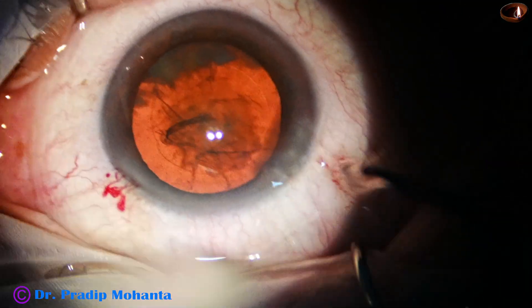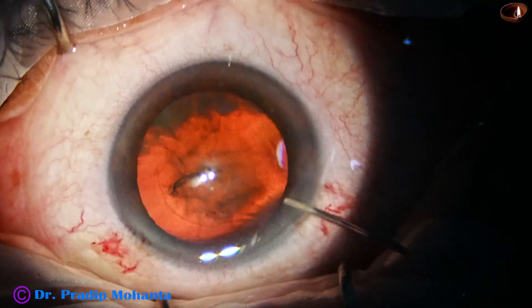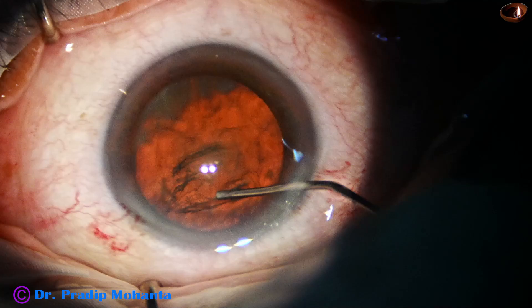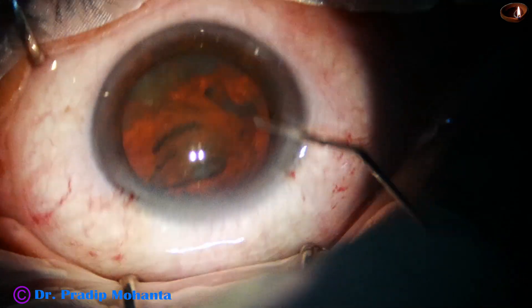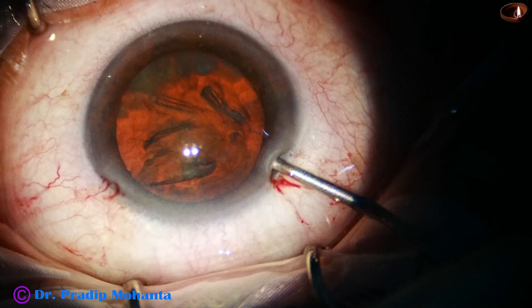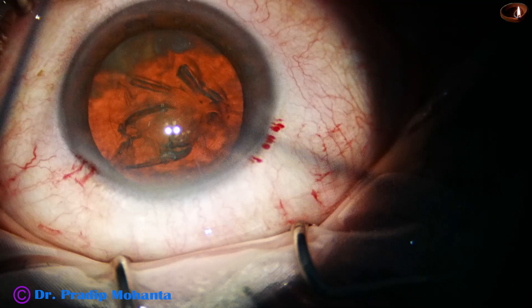But this is actually a cataract which is harder than grade 3. Capsulorhexis is done. Hydrodissection is done. Now the nucleus is tapped. At this time, I did not rotate the nucleus — we will do that after dividing the nucleus with the pre-chopper.